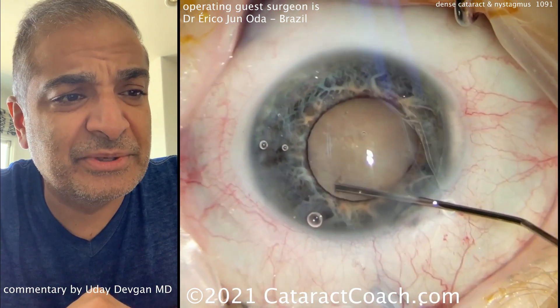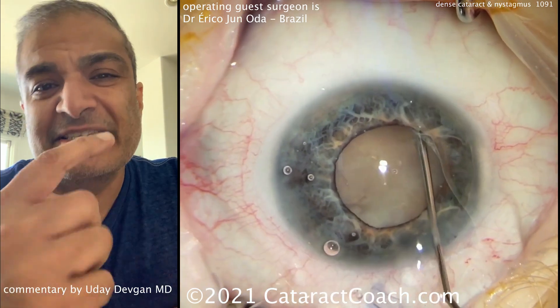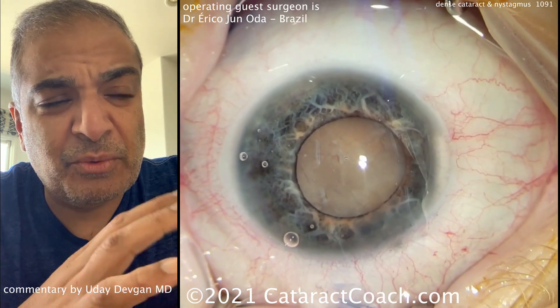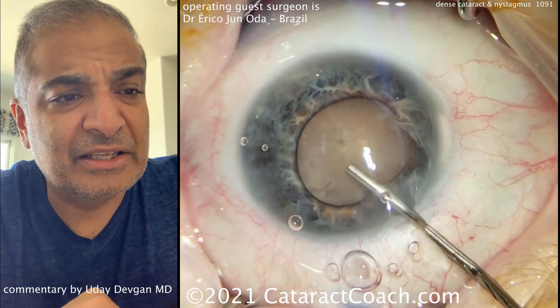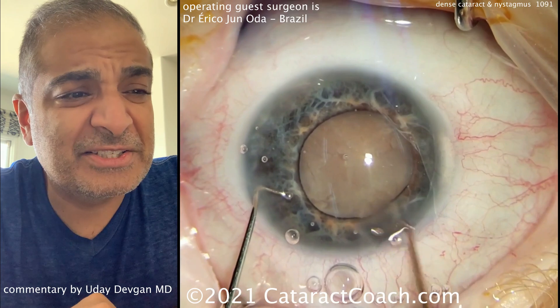Let's see what he's doing next — some hydrodissection, perhaps. Be careful here. It's hard to see the fluid wave go behind the lens nucleus because it's so opaque. So you don't want to put too much pressure in that capsular bag. It looks like a little bit more dispersive viscoelastic agent there.